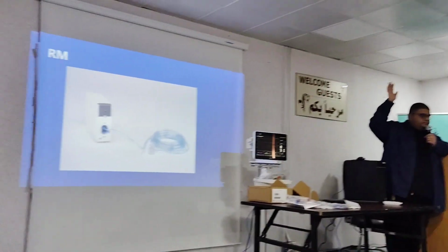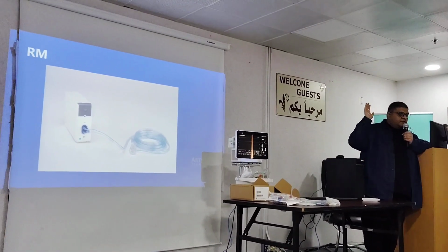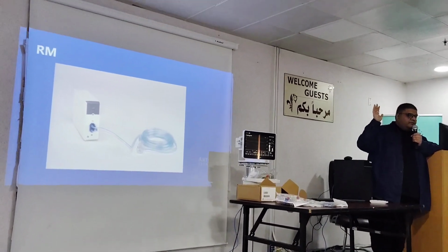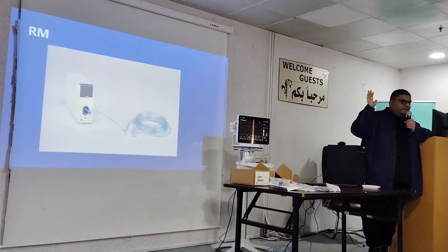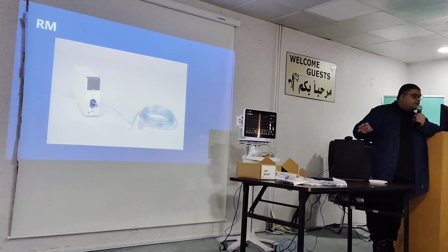RSO2. Okay. What about BIS? No? This we are using in OR. Yes. Yeah, BIS in OR. Yeah, yes. And how about NMT? Okay, so for you guys, RSO2 was interesting.